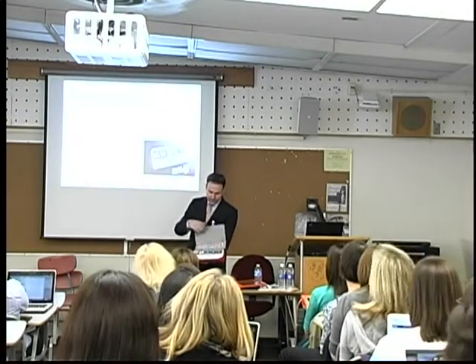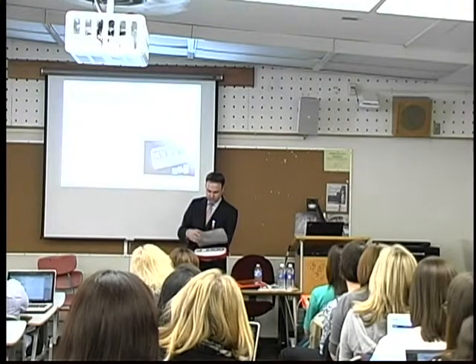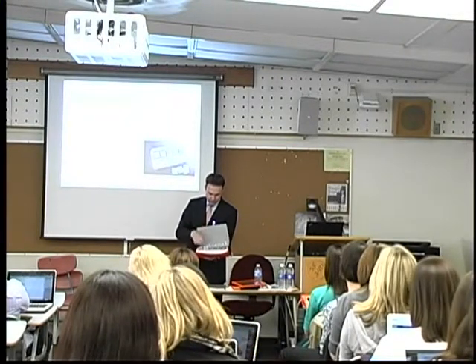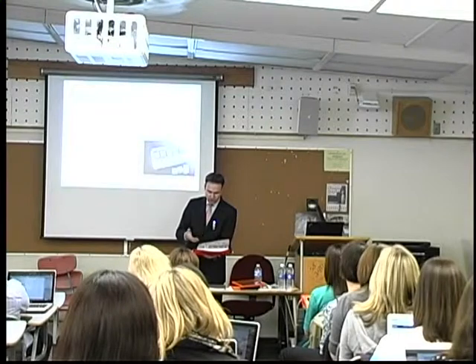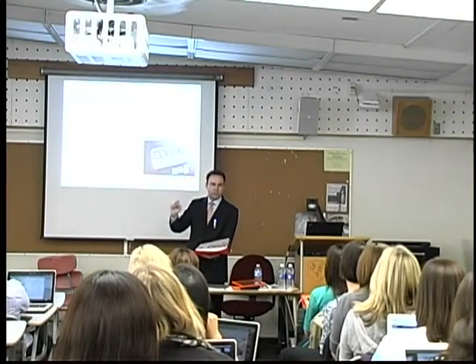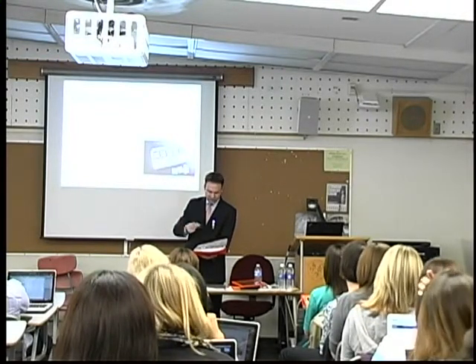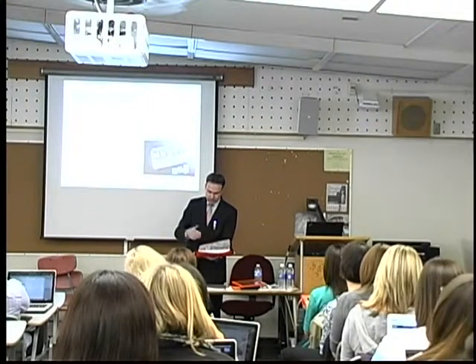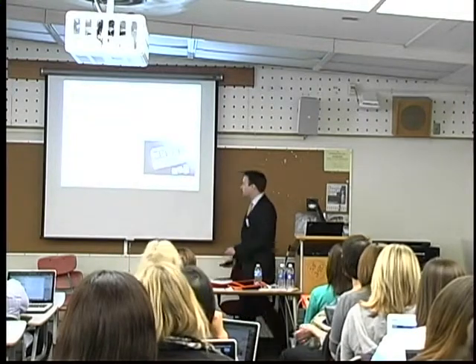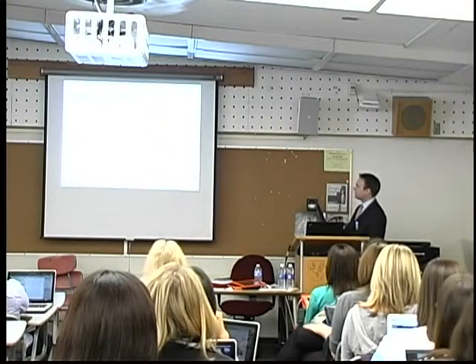And instead of your book, you have these sheets here at the top, and you can construct more and more vocabulary pages and give your learner access to more vocabulary. Basically, all these little cards have a chip behind them, and you can program that through the device and record your own speech on every little picture card. And instead of exchanging, the individual then puts it down here on that sentence strip. We did 3 sessions per week in our departmental speech clinic.